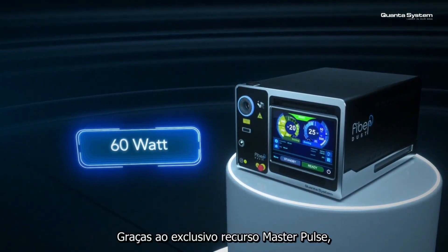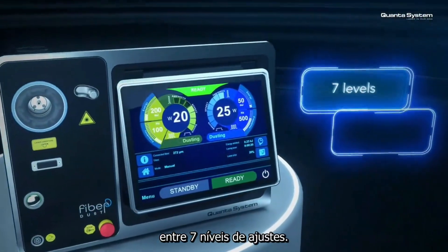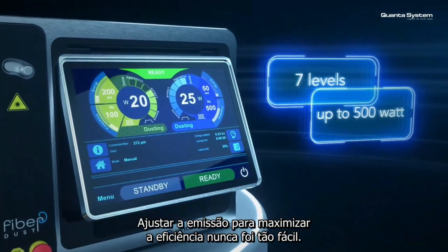Thanks to the exclusive master pulse feature, you can regulate the duration of the laser pulses choosing among seven levels of settings. Tuning your emission to maximize the efficiency has never been so easy.